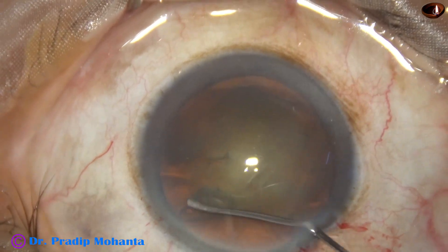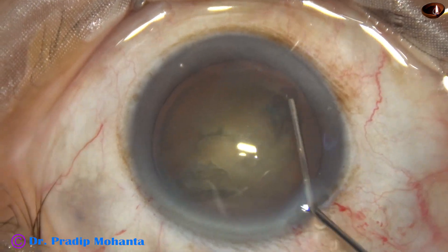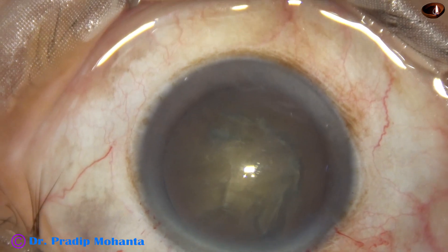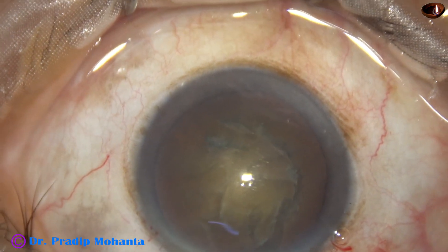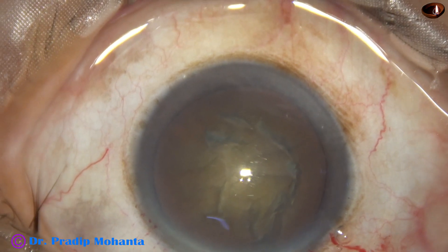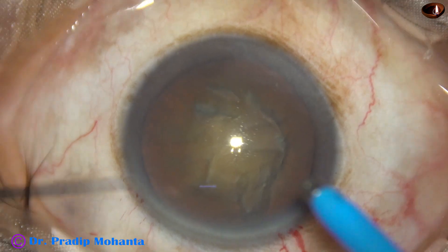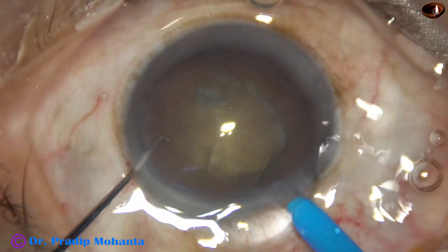This is hydrodissection, and the nucleus is rotated. The nucleus sclerosis in this case is about grade 4, maybe grade 3 plus, but the nucleus is quite hard — not a grade 3 soft cataract.